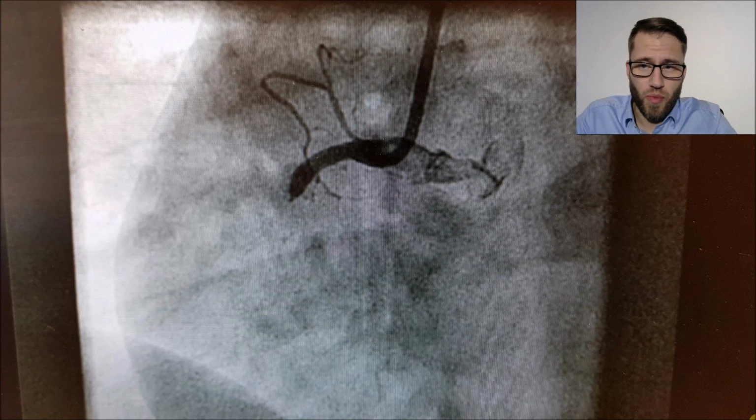And this is what we found. We found an acutely occluded right coronary artery in the proximal to medial part, and you see no RV branches going before that to the right ventricle.